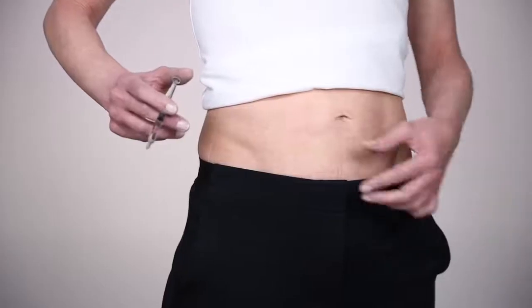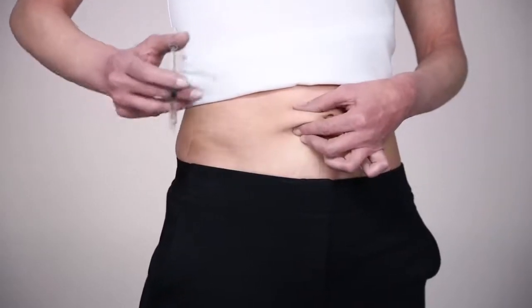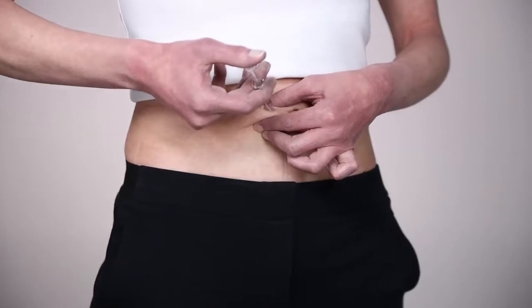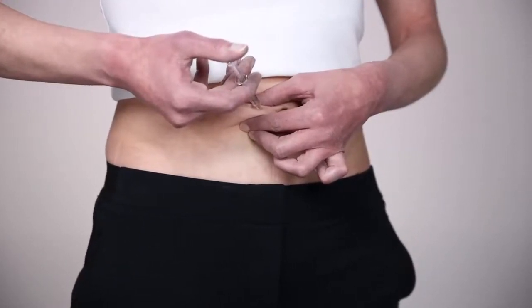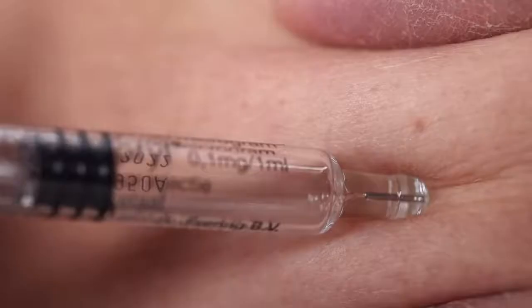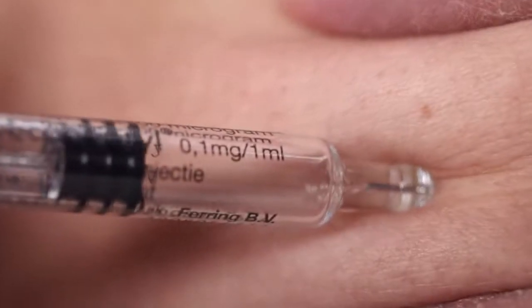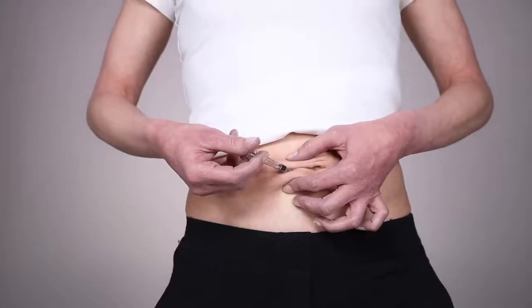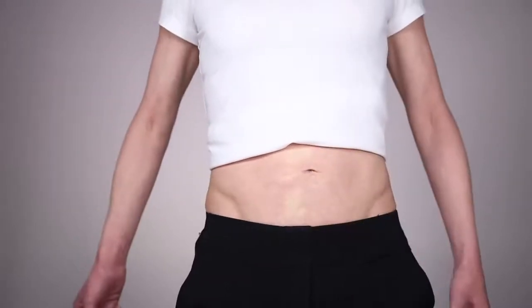Lift a fold of skin between your thumb and index finger. Take hold of the syringe with your other hand using your thumb and forefinger, and pierce the needle into the skin fold with some force. Push the plunger down and slowly inject the contents of the syringe. Remove the needle from the skin in one movement.